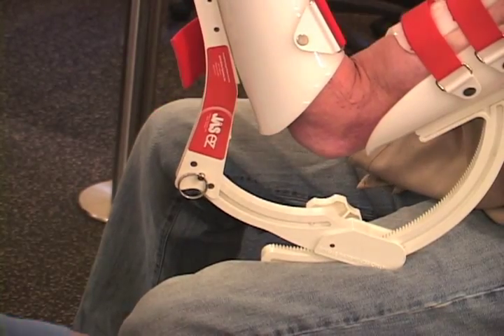This device is an elbow flexion extension brace. It's primarily used for gaining either elbow flexion or extension, so bending or straightening. Individuals that have had elbow fractures or contractures would be prime candidates for this.